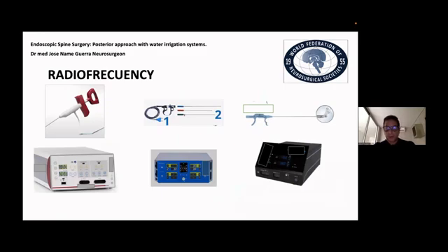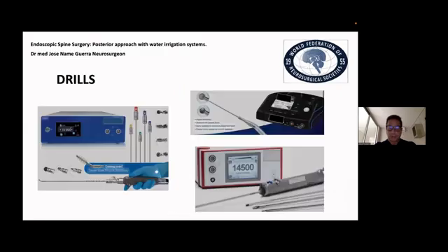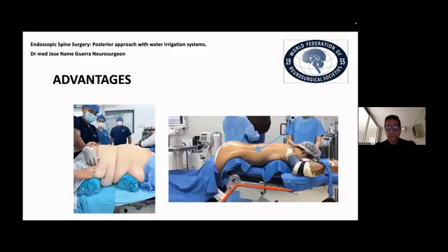We also, in endoscopic spine surgery, use radiofrequency because it produces less heat to the neural structures. The instruments that we use are similar to the instruments that we use in open surgery: forceps, scissors, rongeurs, and many drills like hooded, diamond, and so on. There are many brands and drills in the market. They do almost the same. One of the advantages of endoscopic spine surgery is that you perform the same skin incision in all patients. It doesn't matter what the weight of the patient is.